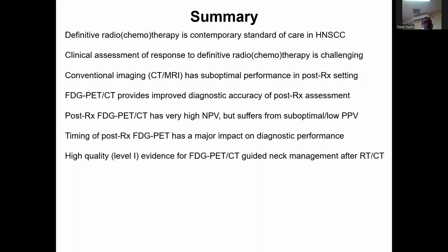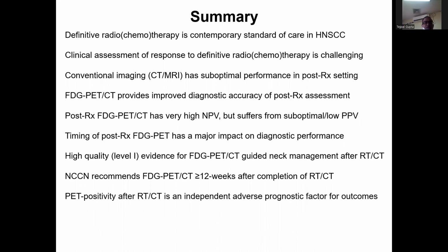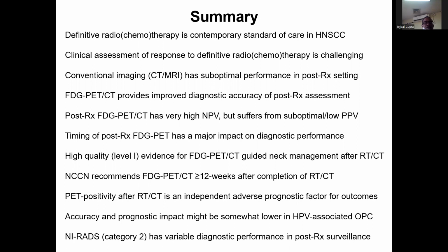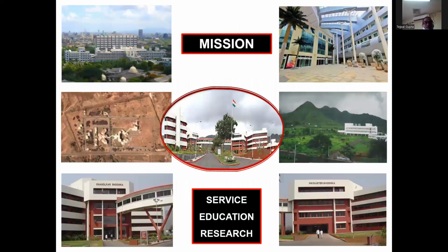Now we have high-level evidence for FDG PET CT guided neck management after definitive radiochemotherapy. The NCCN recommends FDG PET CT at or beyond 12 weeks after completion of definitive radiochemotherapy. PET positivity after radiochemotherapy is an independent adverse prognostic factor for outcomes. The accuracy and prognostic impact might be somewhat lower in HPV-associated oropharyngeal cancer, and NIRADS, particularly category 2, has variable diagnostic performance in post-treatment surveillance.